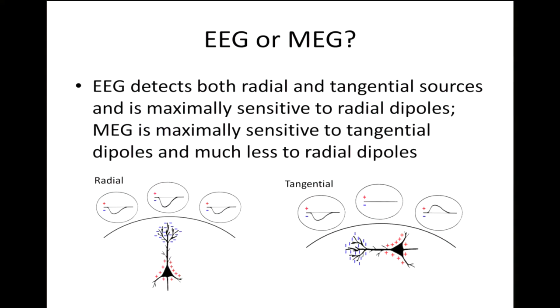Okay, so now if you ask, because yesterday we talked about EEG, and actually once EEG is introduced, people immediately start comparing EEG with MEG, because principally EEG and MEG are picking up the same neural activities. The source is the same. In the EEG, you are picking up only electrical activities, and MEG is picking up the magnetic field out of the electrical activities, out of the flow of ions, out of the flow of currents. But the sources are the same.